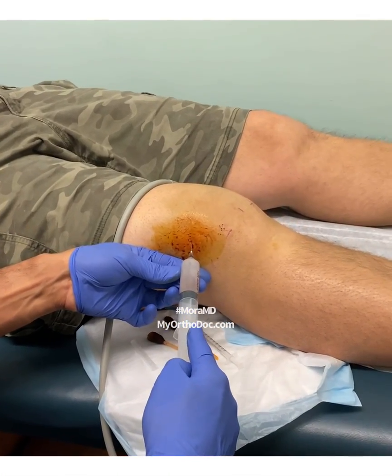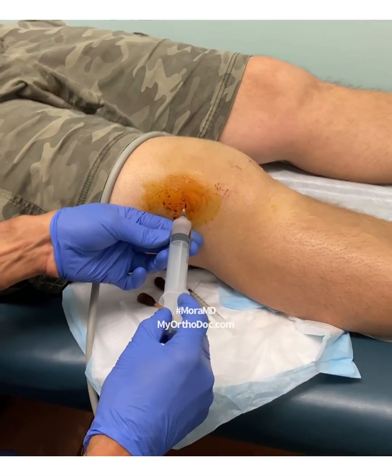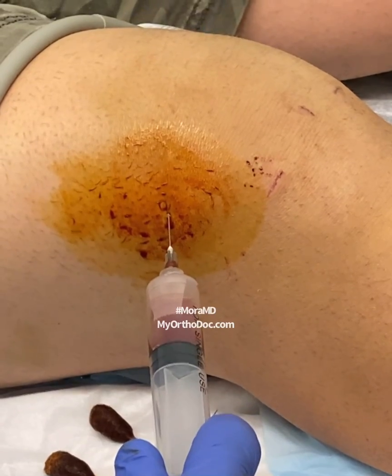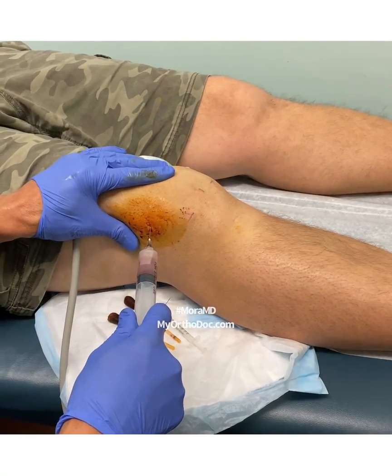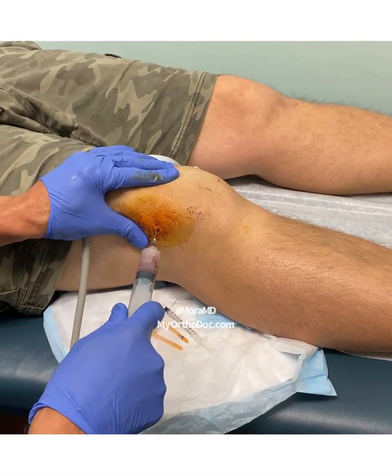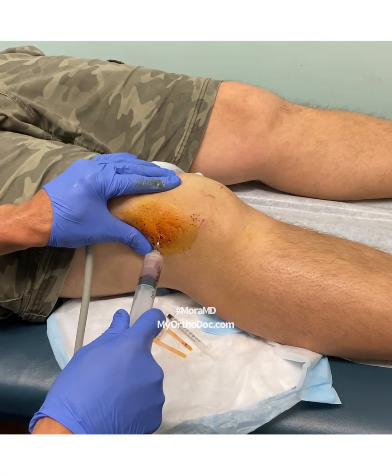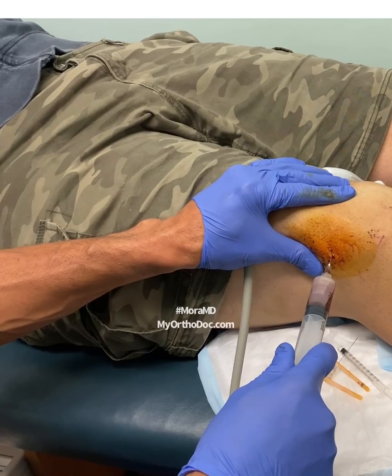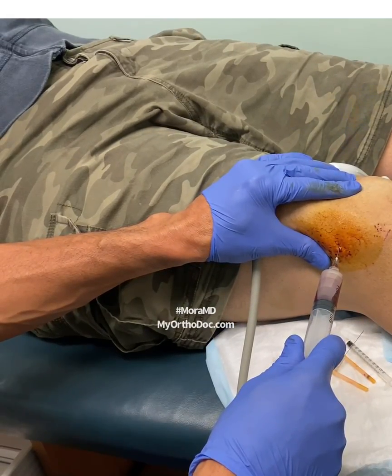It's going to clot up pretty fast. I rotate the needle a little bit and put a little pressure over here. It was slowing down, but there it goes — it's picking up. I can feel the syringe giving, so I know I'm in the right plane.